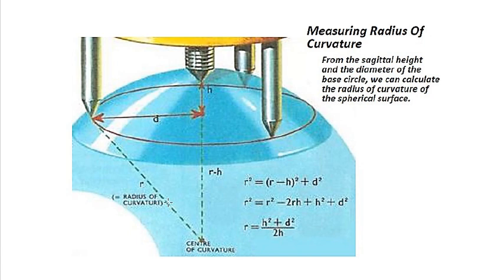From here to here is an r, because this is the center and that is the spherical surface curvature. Therefore that's your r. If you go from here, you can say that the distance from here to here, you can take h out of r, because you're going to get the same r if you go from the center to this point, which is the end of this little screw point.